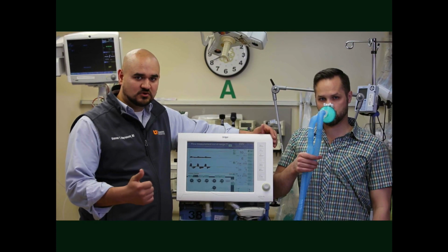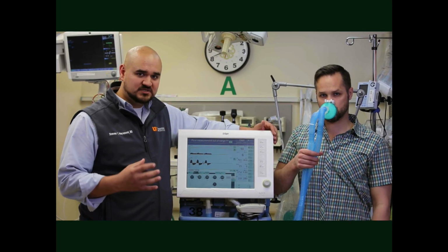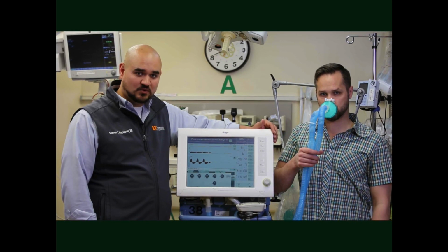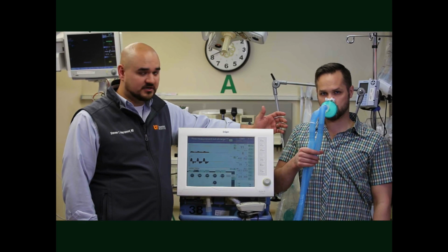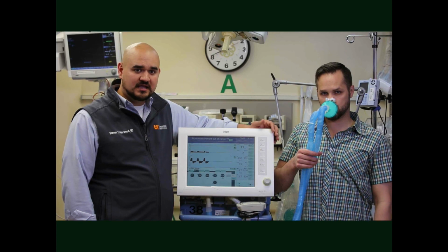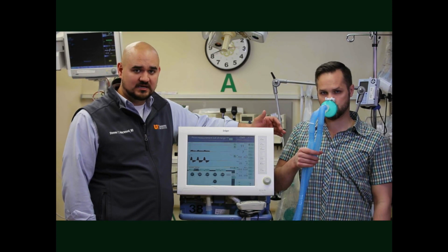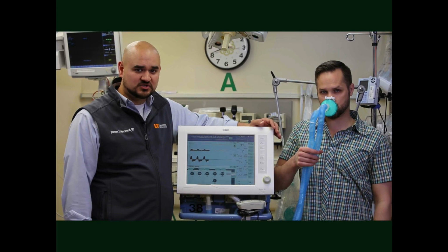So we've gone to assist control. We've set his tidal volume based on his height. Your respiratory rate, you typically want to start between 16 and 20. If your patient's in a lot of distress, if they really need to get those CO2 levels off, you can go higher. If their lungs are pretty good and they were intubated for other pathology, you may need to go lower, but 16 to 20 is a good starting range.